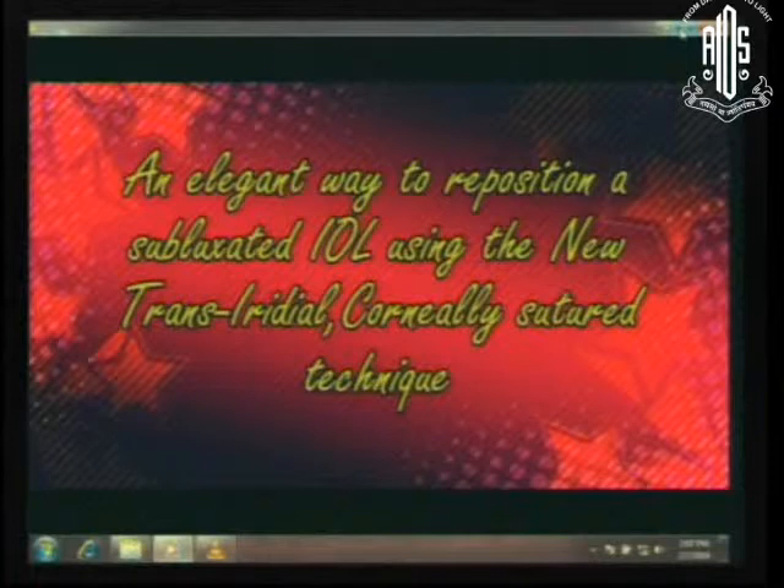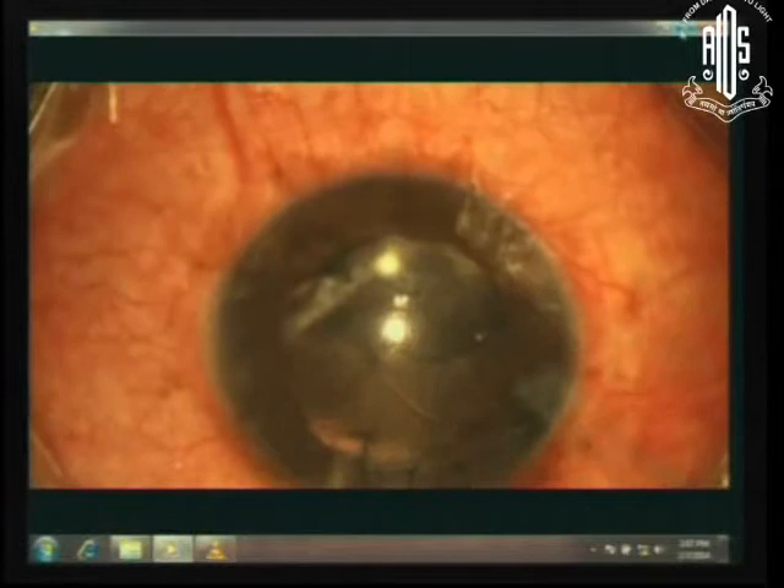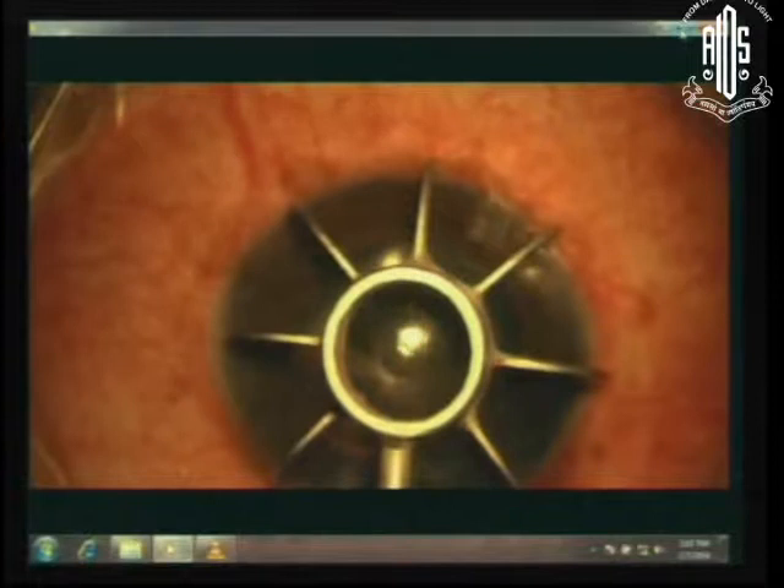When we have a decentered IOL, the question is how do we proceed? I am going to show you two decentered IOLs and show you how to proceed with them. As you notice here, it is a beautifully decentered IOL. A colleague put it in and left me with this to manage. Let me show you this method which I think is quite unique — I think you will like it.